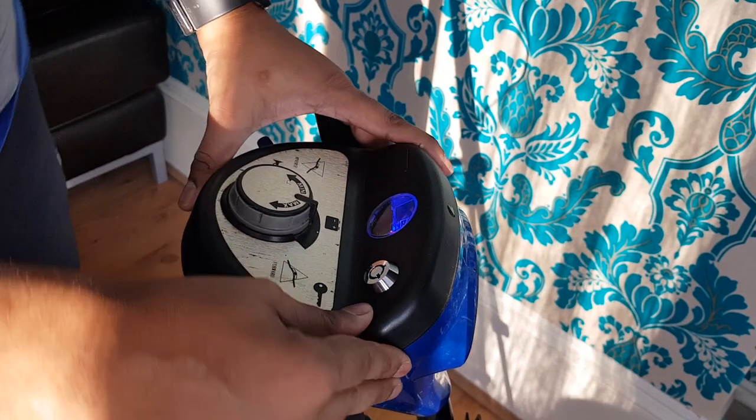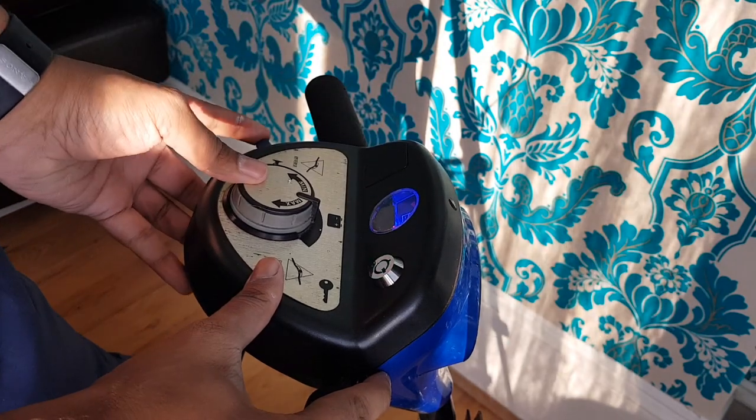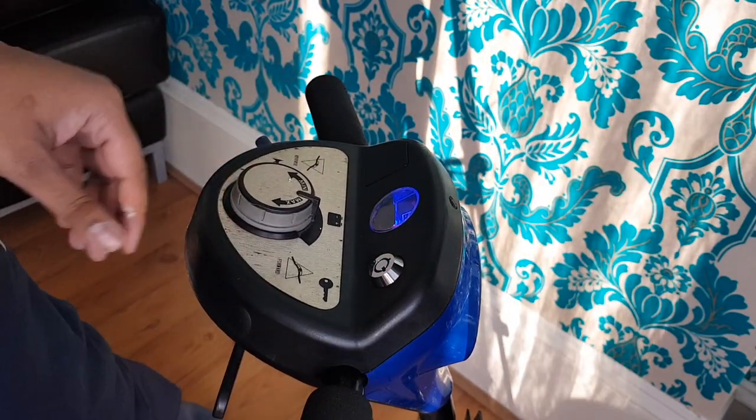Now we're powered back up, the beep's working — hear that? How about that? We're back in business!